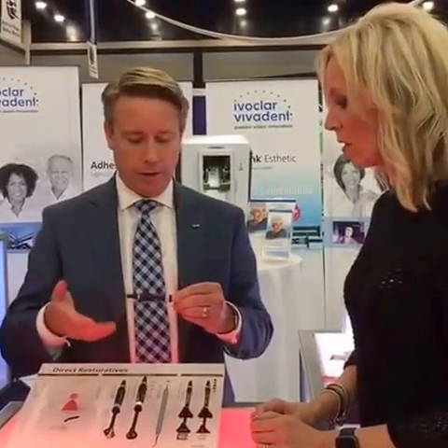Of course, the Tetric EvoFlow Bulk Fill is a perfect marriage between the two, but if there's something else out there, you can use something else.